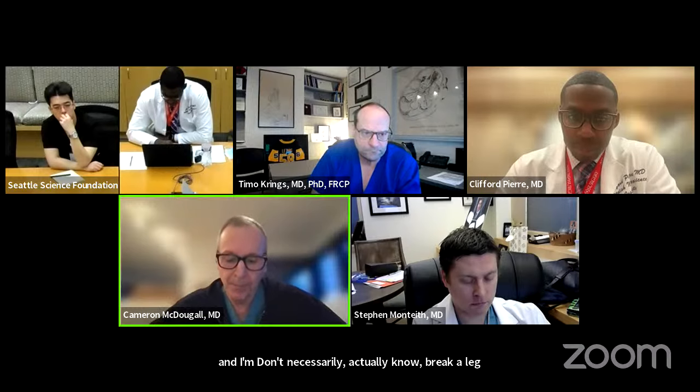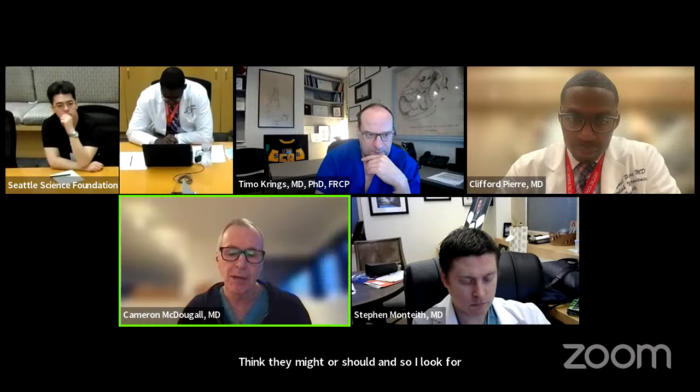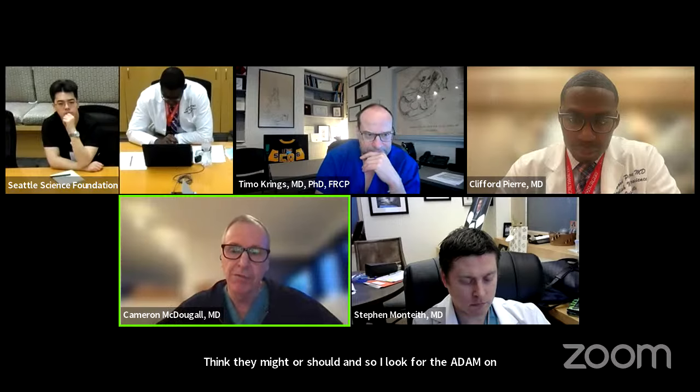Yeah. And then in the follow-up of that, I've become more limited as well and trust on the resolution of edema to help me in the early stage. Patients often aren't recovering that much or aren't recovering as fast as you think they might or should. And so I look for the edema on the follow-up MR. How reliable a thing do you think that is as a way of following up?